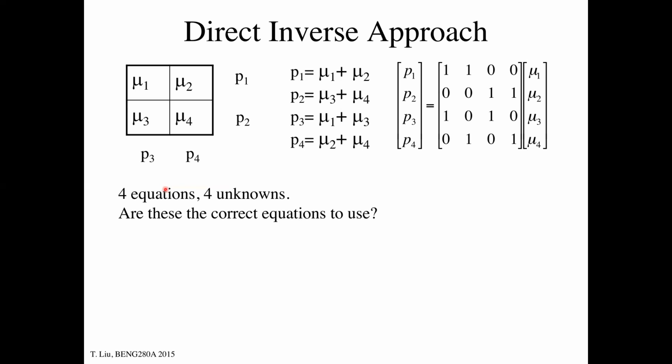So let's look at a really trivial image. This image is a 2x2 pixel array, right? And we're going to try and figure out what the values are of the linear attenuation coefficient in these 4 individual boxes. So this is our first image, a 2x2, very, very low resolution, right? Well, not necessarily. If these boxes were 2 microns, it would be high resolution, but it's a very small field of view.